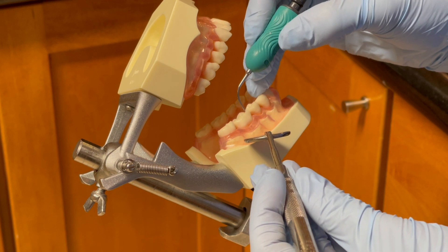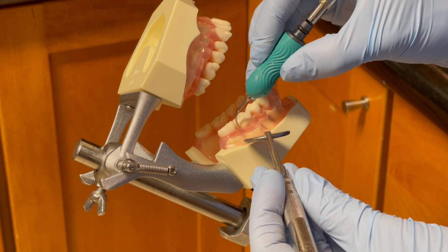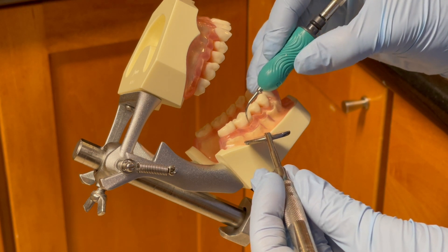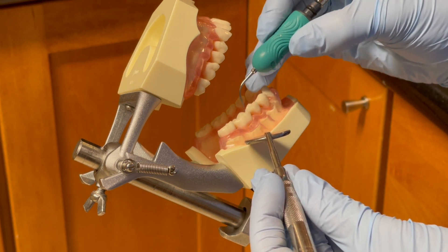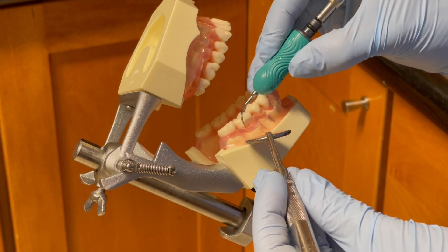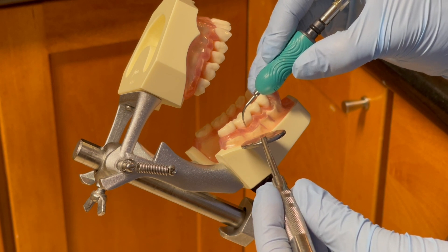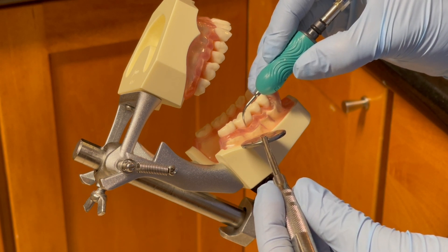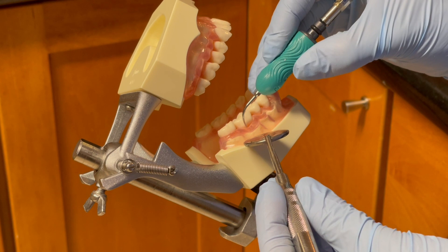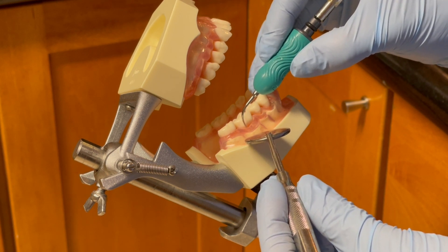Before activating the USS, I explore with the USS tip on the tooth to locate any deposit. Then I insert the tip at the distal buccal line angle with vertical orientation, adapting the 2 to 3 mm of the lateral surface of the working tip to the tooth surface, maintaining at a 15-degree angle.